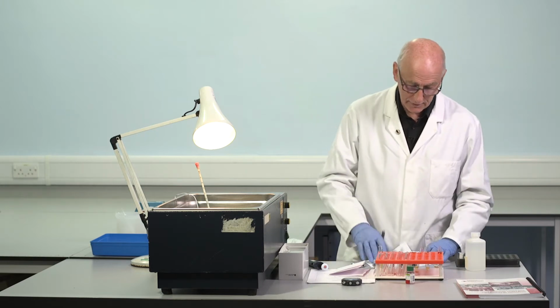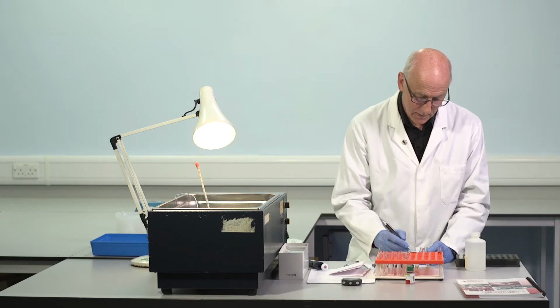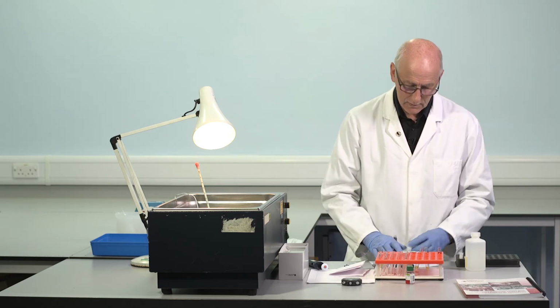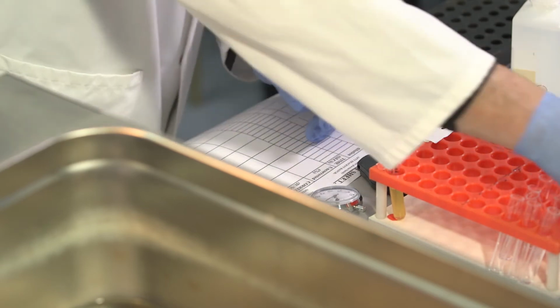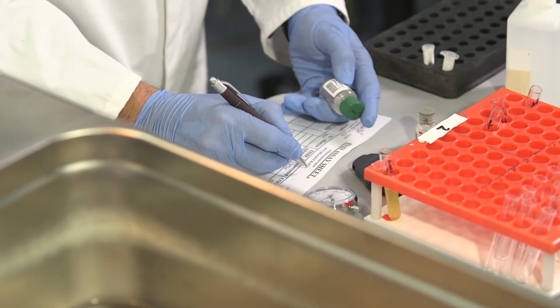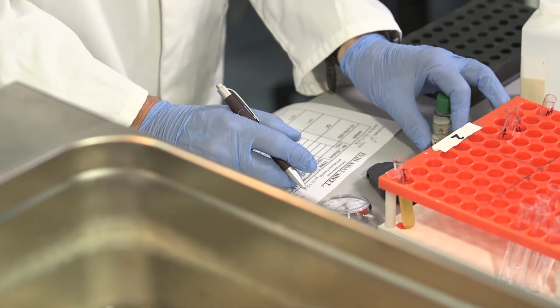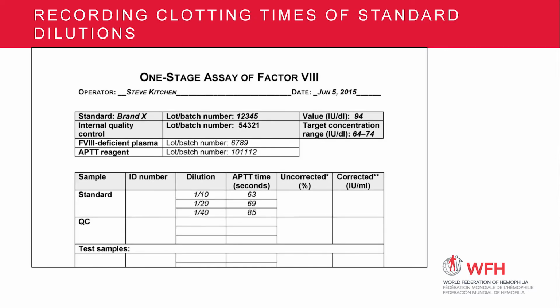So I'm going to record on here some of the information that we've used. So, which is the standard, which is the lot number of this, the date, my name, the APTT reagent batch number, and the deficient plasma batch number, all of which will change from time to time. We can use this also to record which of the dilutions that we've used. These may not always be the same for reasons we'll discuss. These first three dilutions are standard, 1 in 10, 1 in 20, 1 in 40.